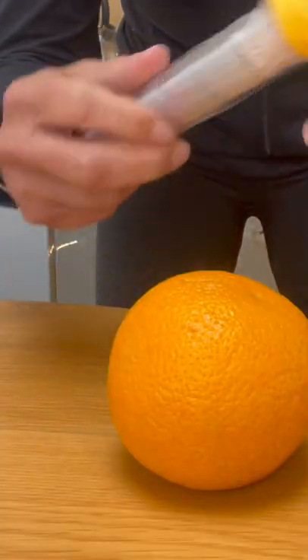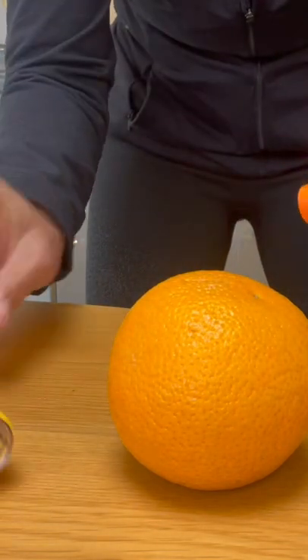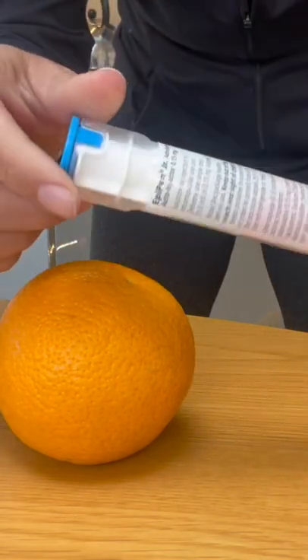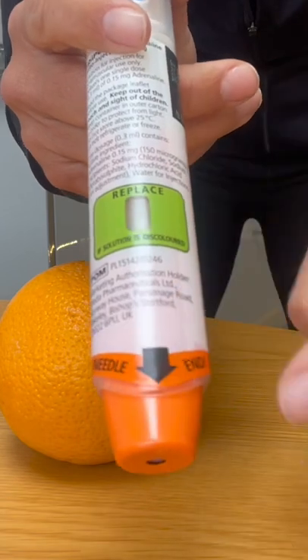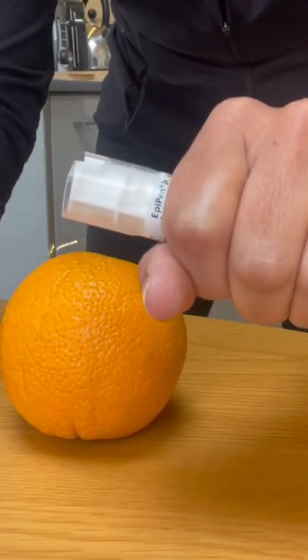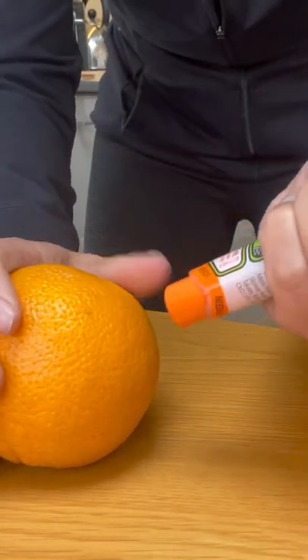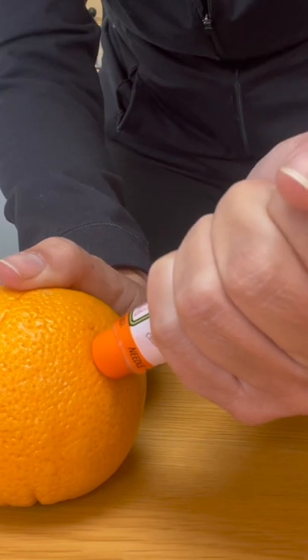So here we have the child EpiPen, and we've got our orange. We're going to take the EpiPen out of the case and look at it. You can see it actually tells you which way the needle's going to come out — it says 'needle end.' Remove the safety cap, then hold the orange, which would be our thigh. Hold the EpiPen up against the orange and push until it clicks.